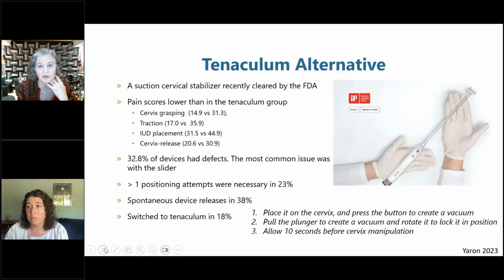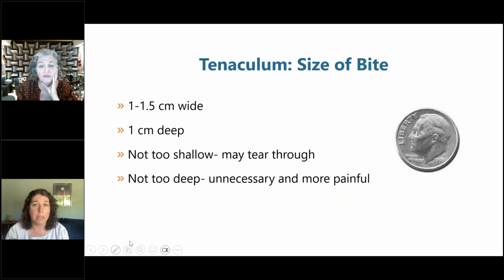So that's reproducible, and they have actually jiggered the device a little bit, and the amount of detachments were better in the more recent studies. Yep. And the company is Cervix. That was just somebody asked that in the chat.